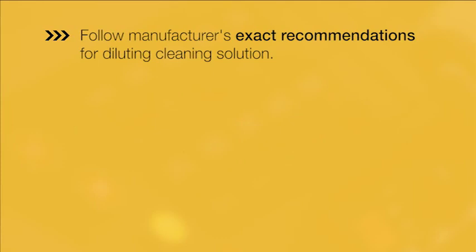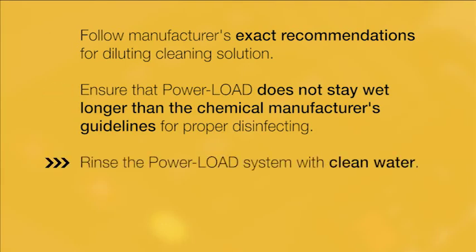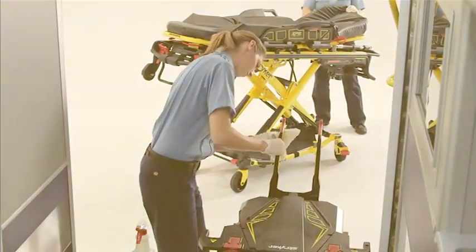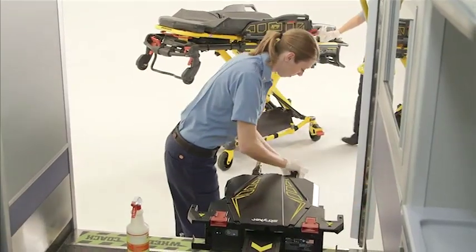Follow the manufacturer's exact recommendations for diluting the cleaning solution. Also, take care that your unit does not stay wet longer than the chemical manufacturer's guidelines for proper disinfecting. And finally, rinse your PowerLoad system with clean water, then dry it thoroughly. A preventative maintenance program should also be implemented for your PowerLoad cot fastener system.